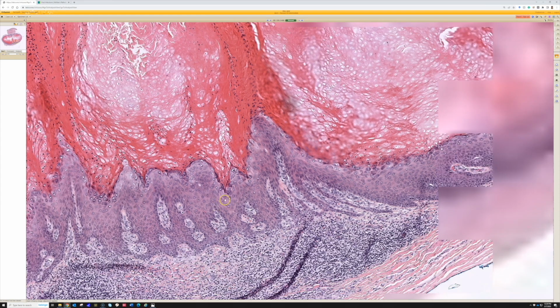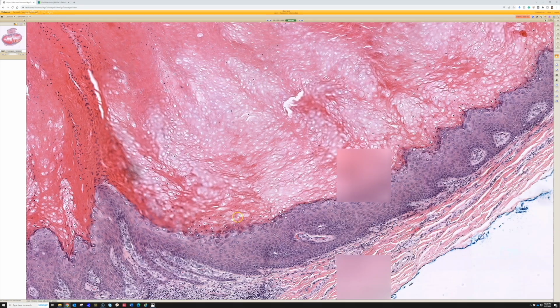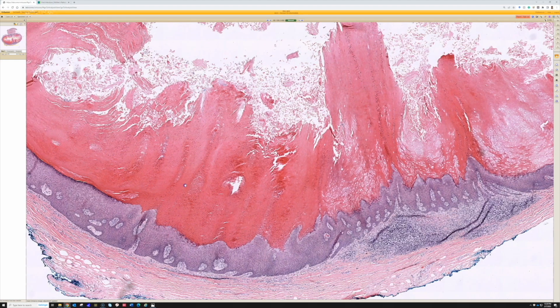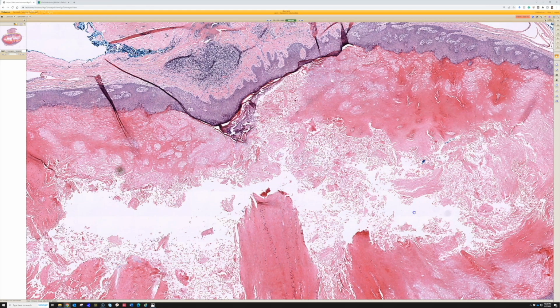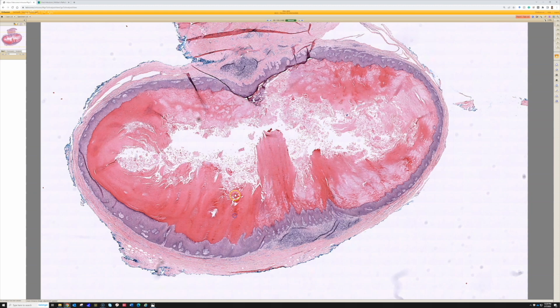And the lining tends to look like epidermoid cyst or follicular infundibular cyst, but sometimes it can also look like pilar cyst or tricholemmal cyst, whichever name you prefer for that entity. So you can have a variability in the cyst lining, but it's benign and it has warty changes. And this is, I think, a very nice example of a verrucous cyst. So a benign verrucous cyst, just a kind of curiosity to know about.